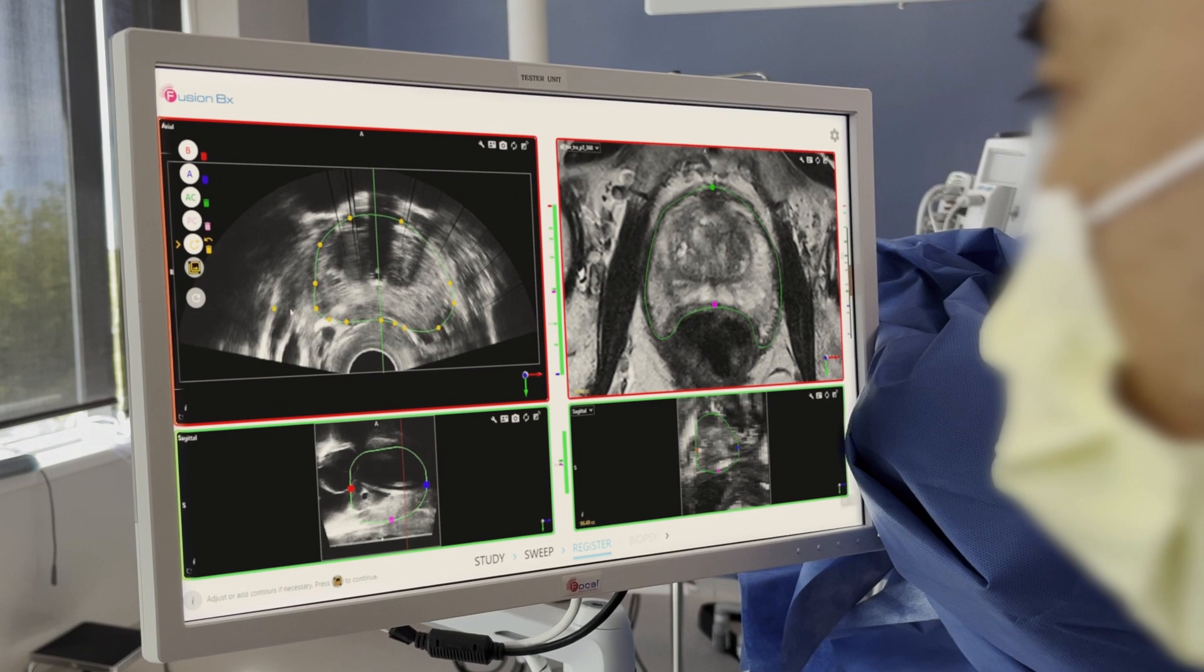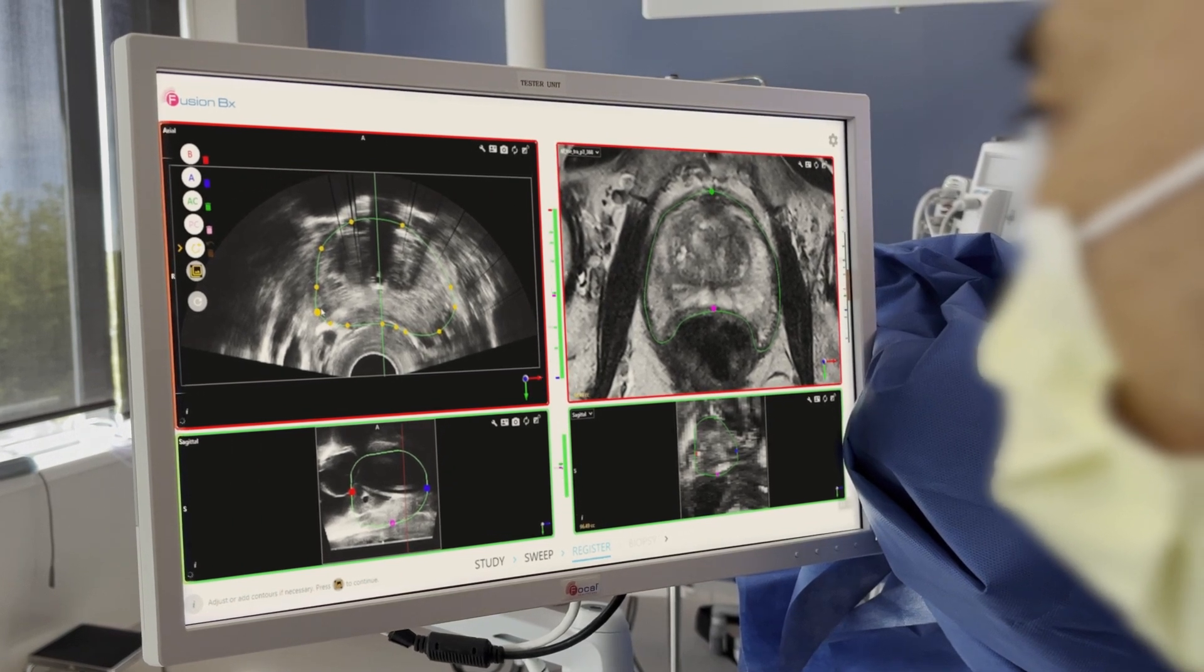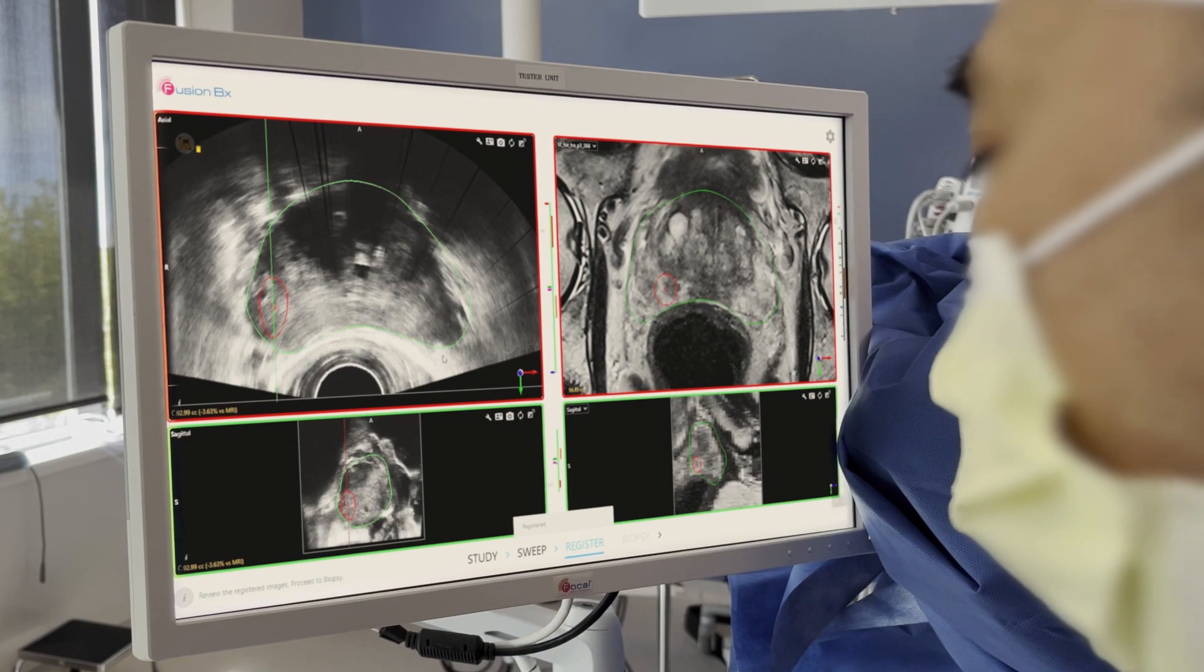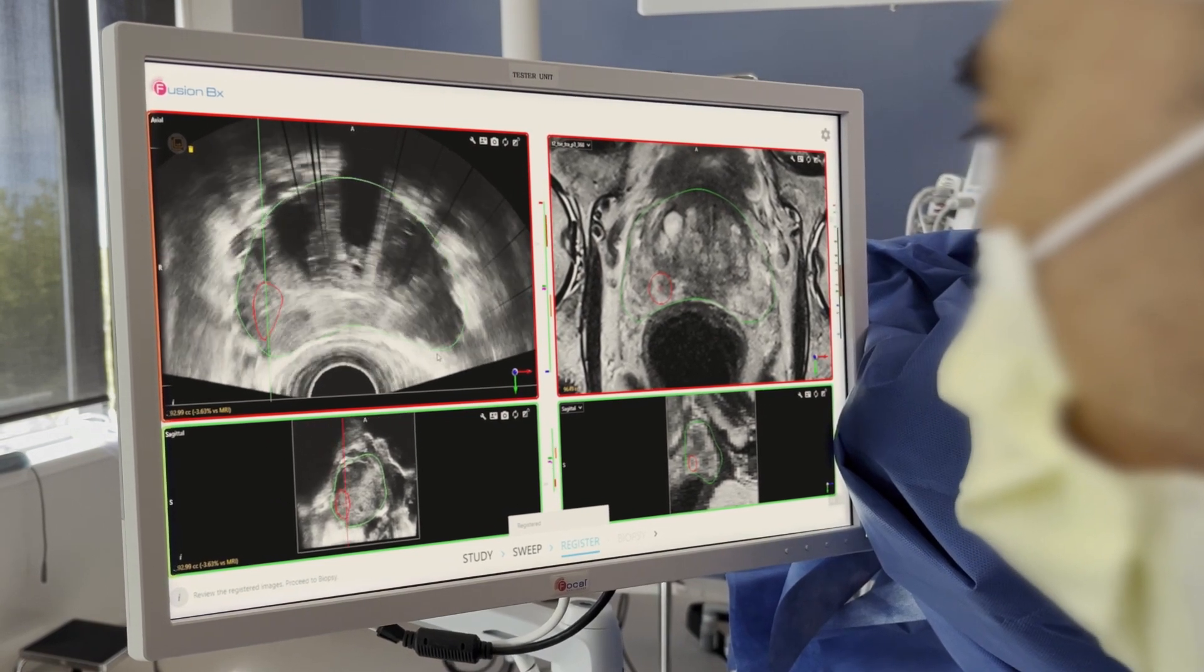Using elastic and rigid registration, the Fusion BX fuses MRI with live ultrasound to create a 3D model of the prostate along with target lesions.